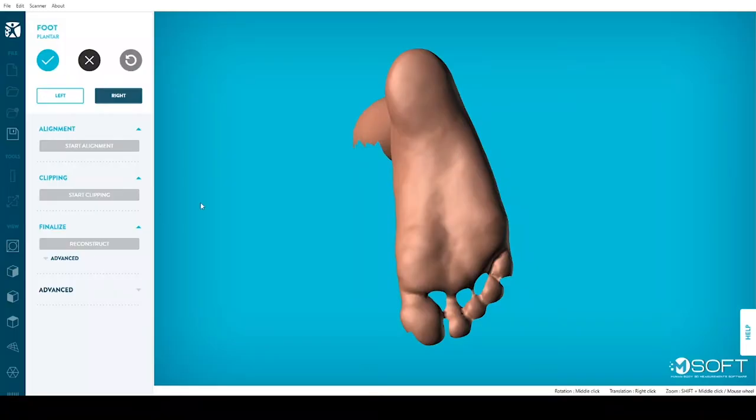Processing a plantar surface scan with M-Soft is possible in three easy steps. First, click on Start Alignment.